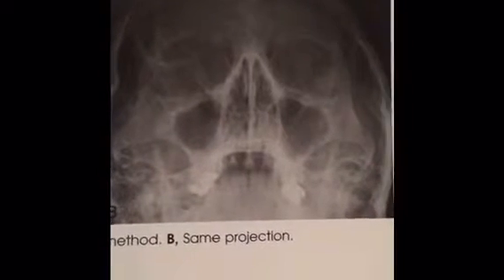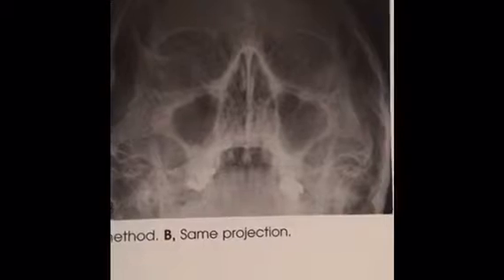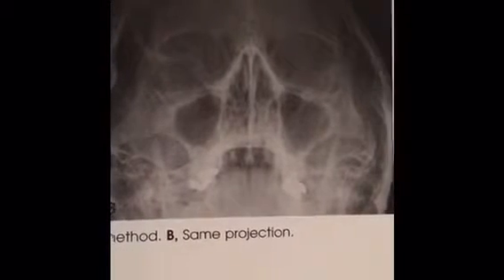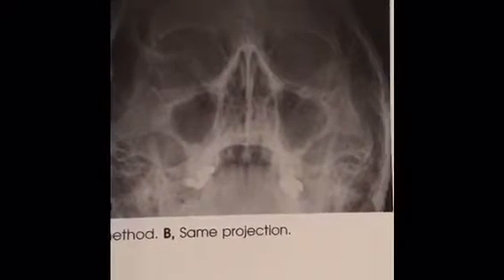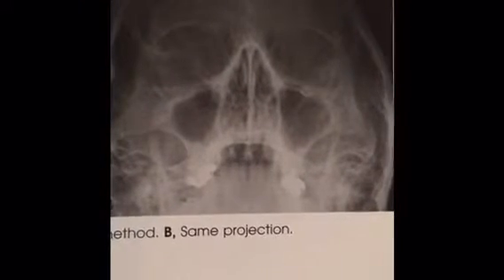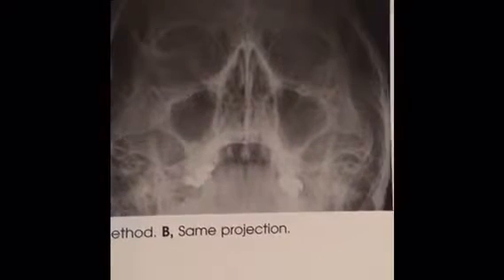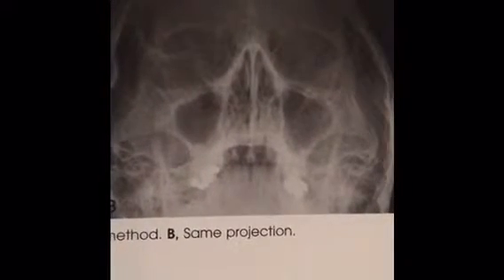You're going to have no rotation, and this is demonstrated by equal distance between the lateral borders of the skull and the lateral border of the orbits on both sides. Orbits and maxillary sinus symmetric on each side. The mid-sagittal plane of the head is aligned with the long axis of the collimated field.